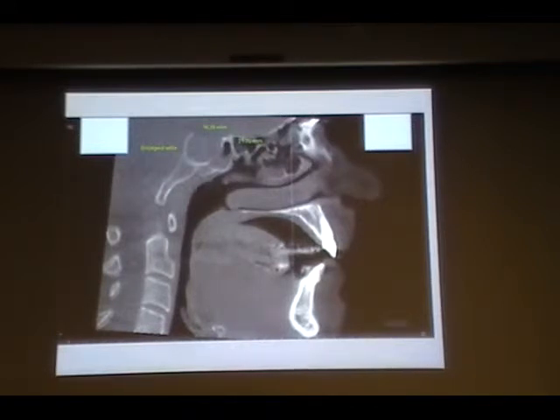The other thing that you have to check is, you can see there is a white line here, right? And there is a white line, but you are not seeing this white line. But there is also something going on. We talked earlier, I think in the panoramic radiograph, the air-filled sinuses should look black, because they are air-filled and X-rays can pass through, right? Can you see the sphenoid sinus there?